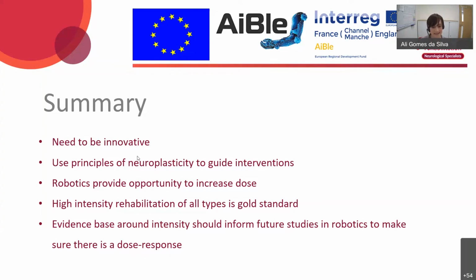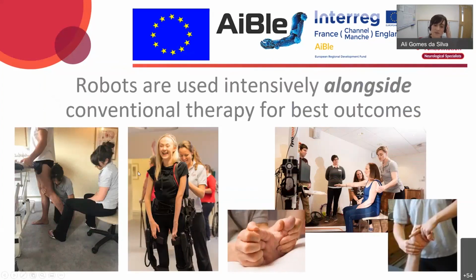Next slide, please. This is my final slide. All I'm going to say is I am a therapist. Robots, just a reminder, are used intensively alongside conventional therapy for the best outcome. So it's not a competition between conventional therapy versus robotic. It's about working with those two things in partnership and clinically reasoning why you would want to use a robotic as part of your treatment and what your functional goal is that you're working to achieve.